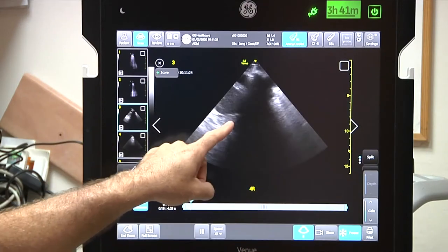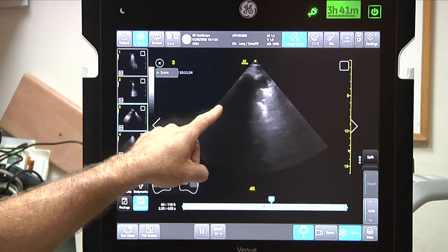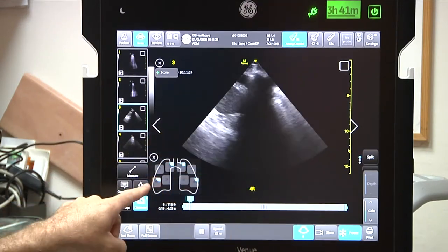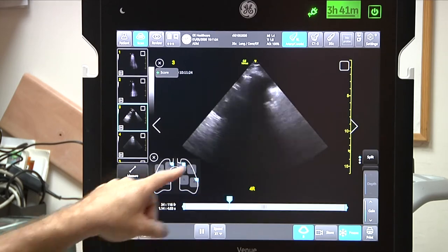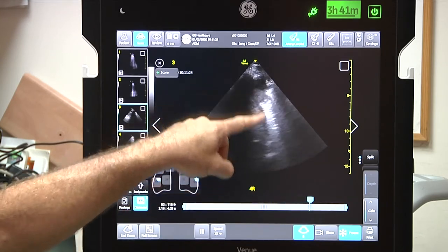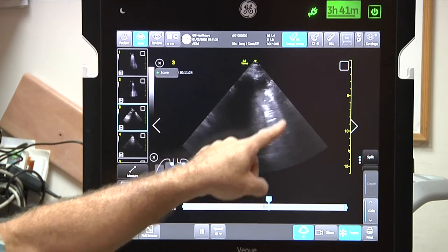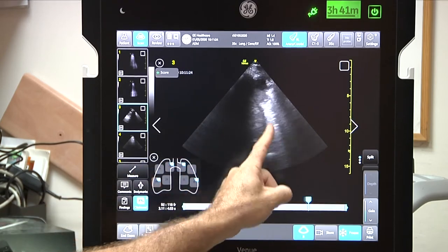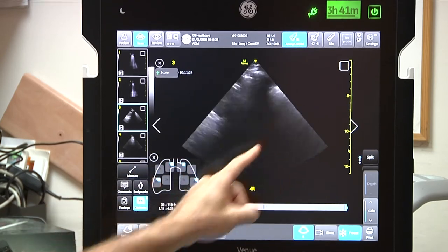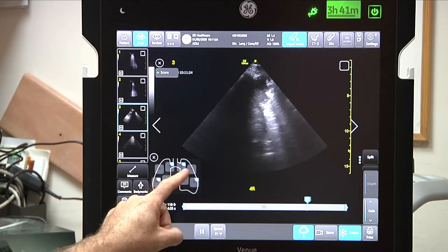Here we can see a COVID patient with a consolidation. We can see that we are on the right side, so that should be the liver and diaphragm, and this is the air bronchogram here — a dynamic air bronchogram of COVID.